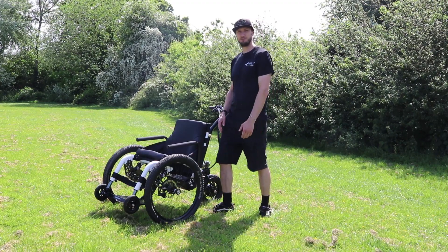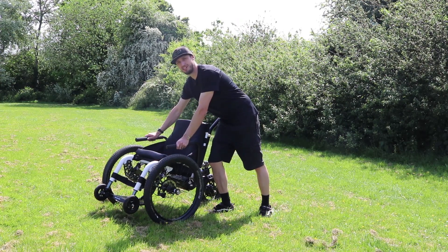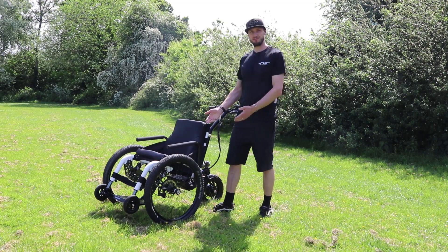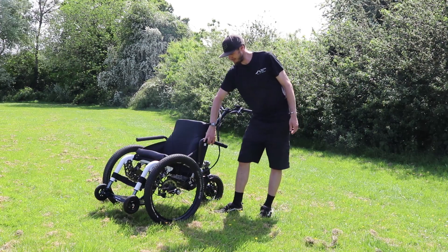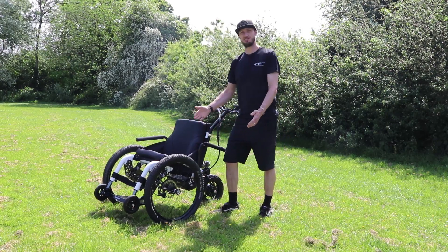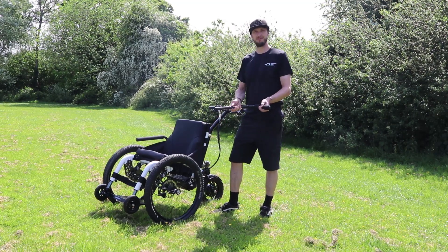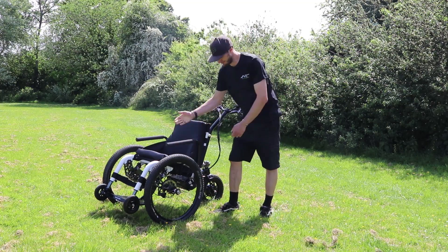The armrests can be used to help you transfer into the trike. Simply use them to support your body weight when sitting back into the seat. Or if you prefer them to be out of the way, simply lift them up, rotate them around to point backwards and they're out of the way to help with a side transfer. Or if you want to remove them fully, slide them out, transfer in and then you can put them back into position when you're ready to go.